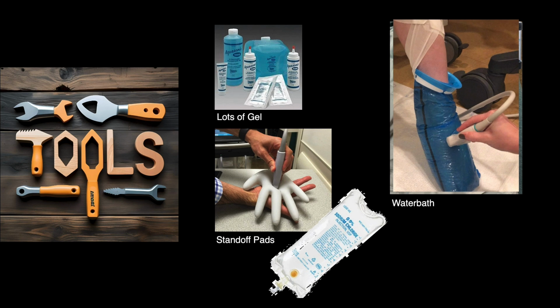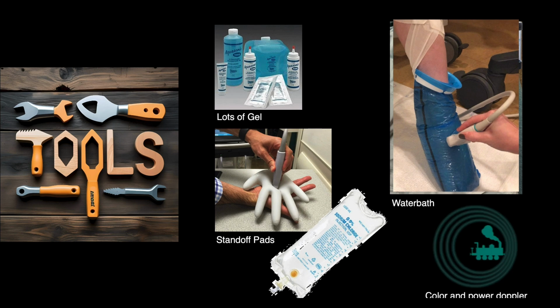Water helps improve your probe contact and provides a nice acoustic interface to see structures, specifically when they are not smooth. Note that the probe in a water bath does not need to contact the skin because you are actually maintaining that contact with the fluid itself. This is great for imaging hands and feet and also helpful with kids. You can also use Doppler, which can help to identify inflammatory conditions associated with increased vascularity or inflammatory reactions.